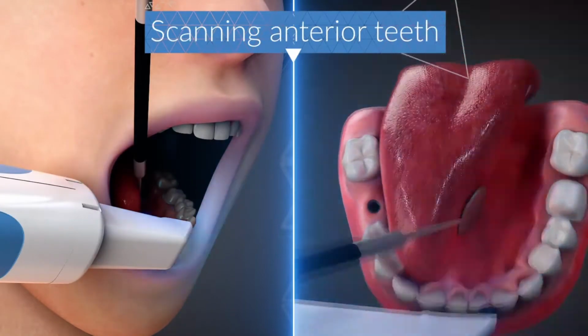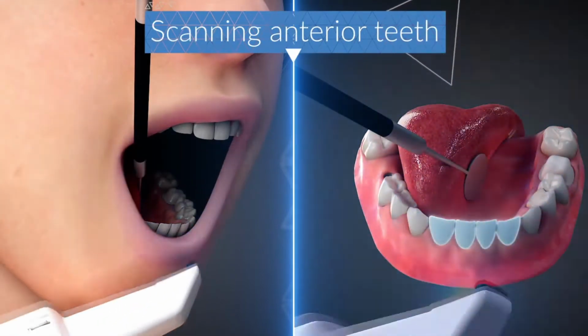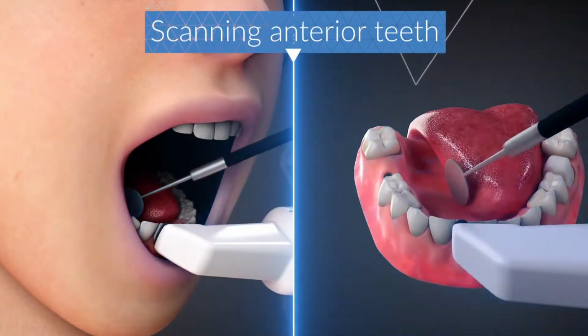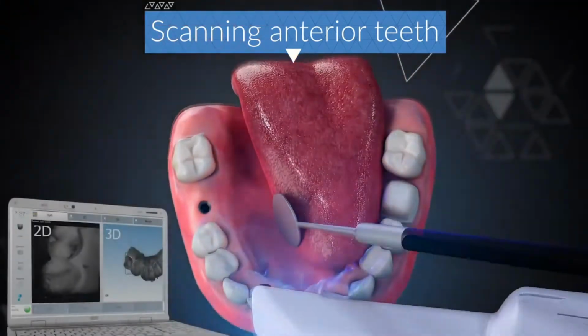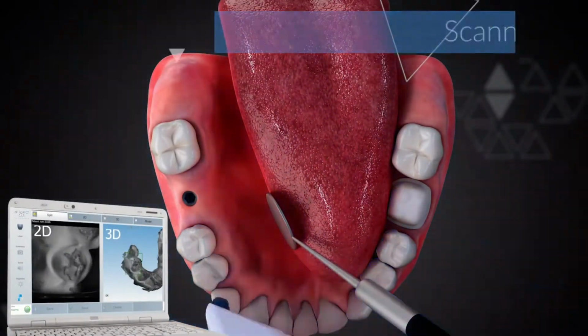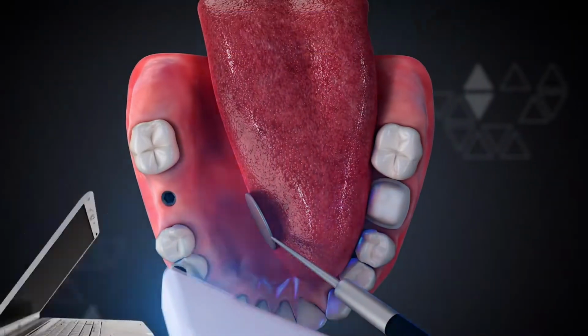When scanning the anterior area, pull the scanner out of the mouth. Rotate it outside of the mouth and then overlap the previously scanned area and complete scanning. Ensure the scanned tooth is at the center of the 2D screen. Adjust accordingly to maximize results.